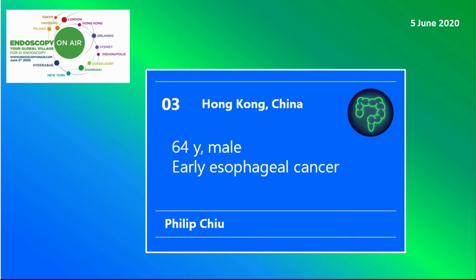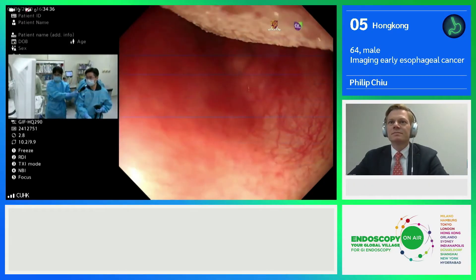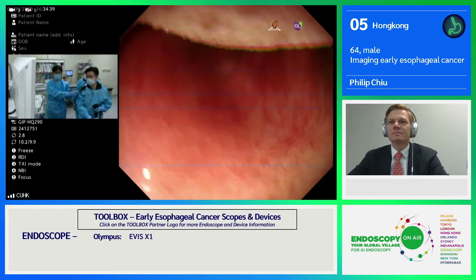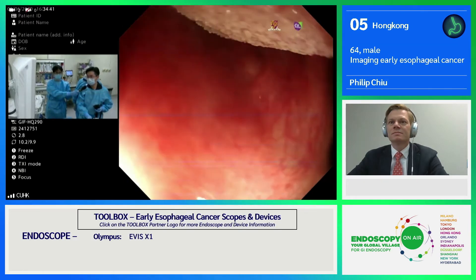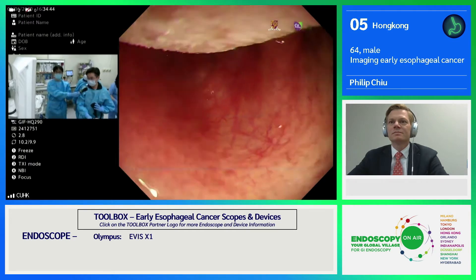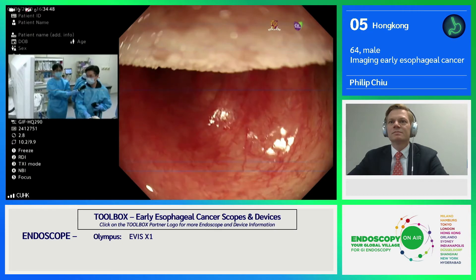Welcome to Endoscopy on Air. Watch Philip discussing the diagnosis of early esophageal cancer. This is the endoscopic image under ordinary white light from the processor. The processor uses LED light and can be changed to another mode called the TXI mode.